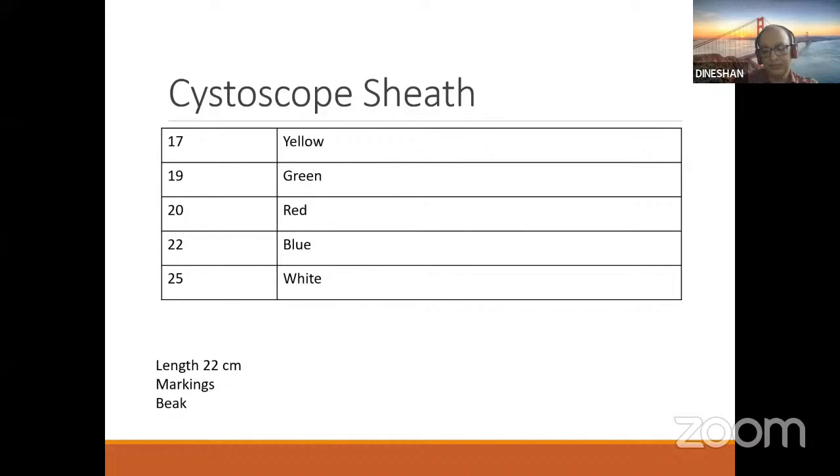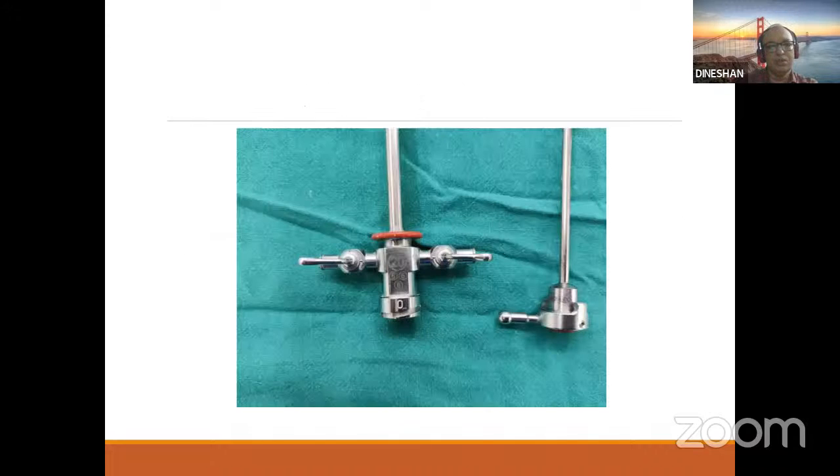Now coming to the different parts, you can see the base, the proximal end of that sheath, where you fix the bridge.